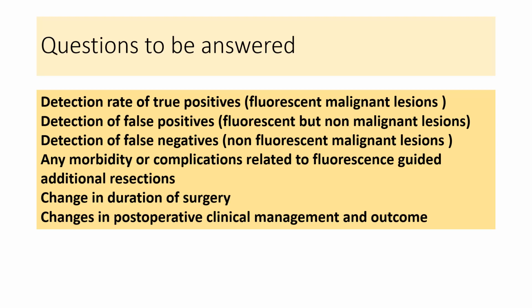Then there is a false negative, that is, non-fluorescent malignant lesions. We will see the reason. If the blood supply to that malignant lesion is very less, then the dye will not reach that particular lesion, and then it will become non-fluorescent.